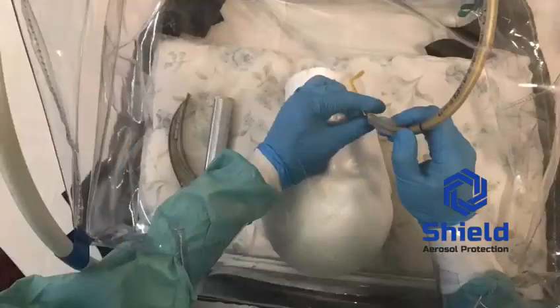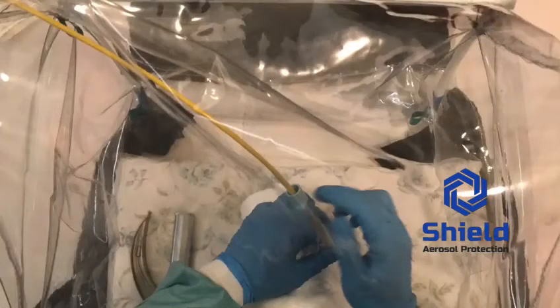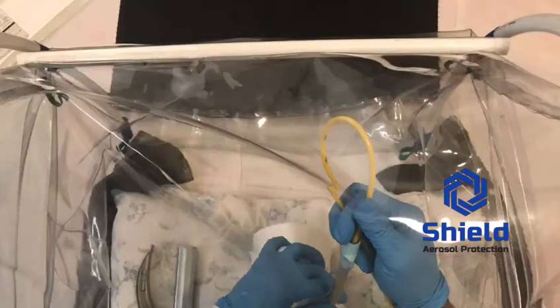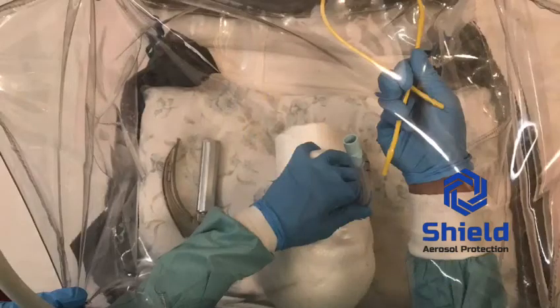Once the bougie is passed into the larynx, the tube is railroaded over the bougie and gradually the bougie is removed. That can be done either by coiling it, as this anaesthetist has done, or it can be done by pushing it out of the flap, the front horizontal flap of the tent, for the operating department practitioner to accept.